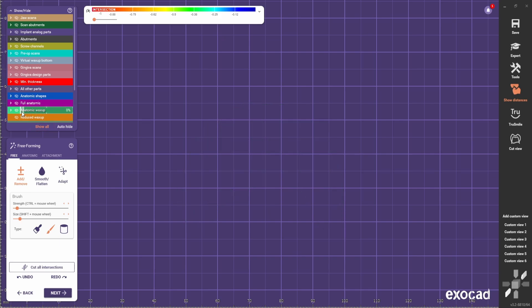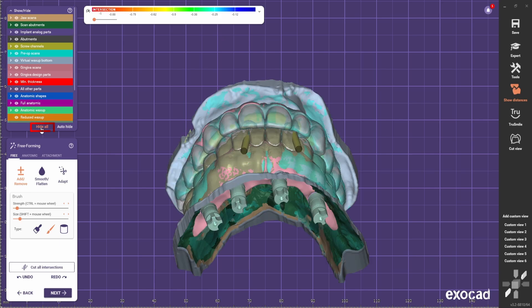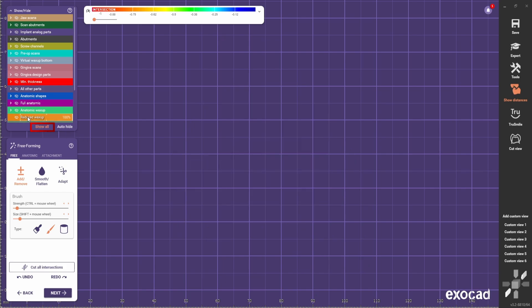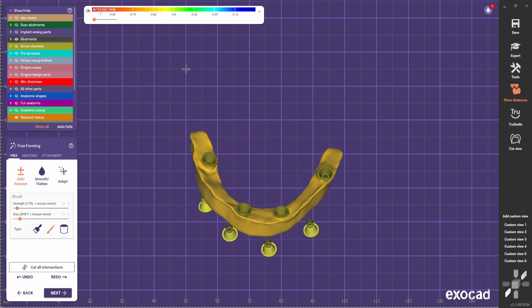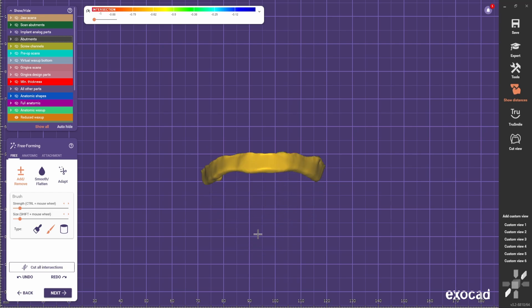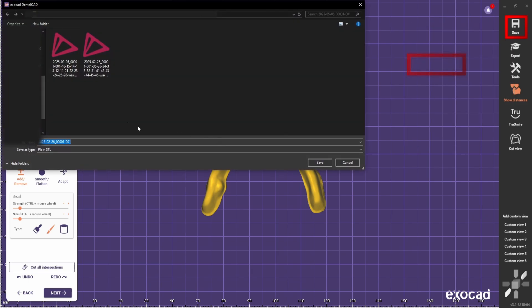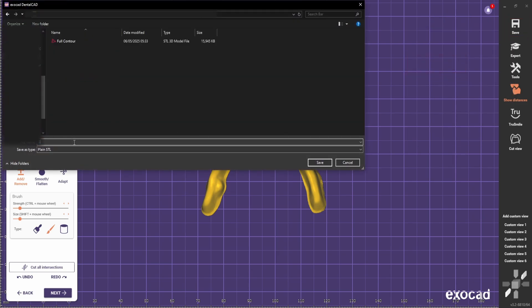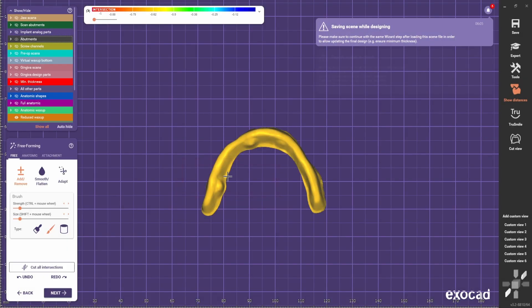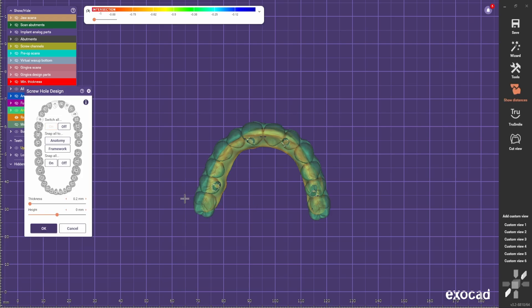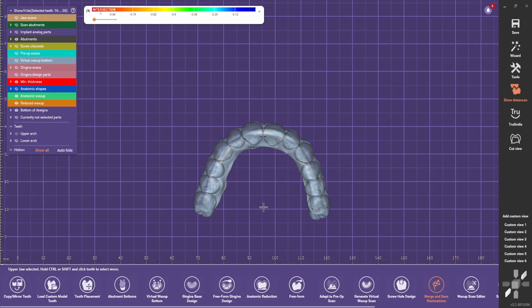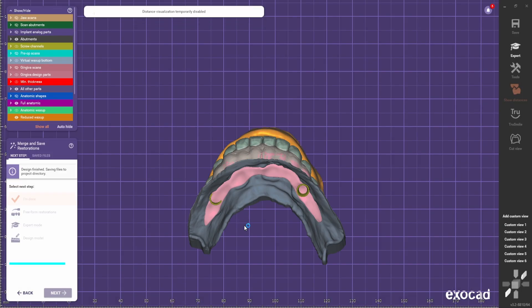We're going to bring up the reduced wax-up. Usually I like to hide all and just bring up the reduced wax-up and the abutments. We're going to save this one — export scene to mesh — and call it 'no holes'. Save visible objects only, use default coordinate system. Before going next, come here to screw hole designs and select the option off. Press OK and go to the next stage, and it's going to create the holes on the bar.